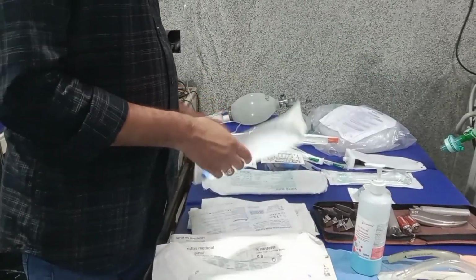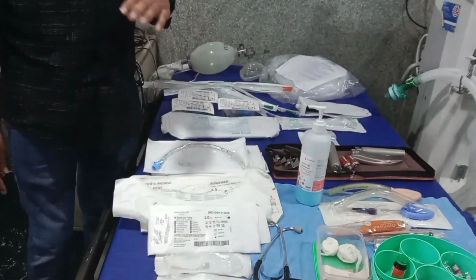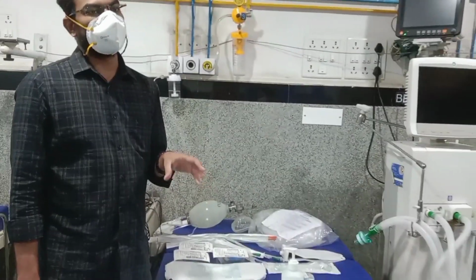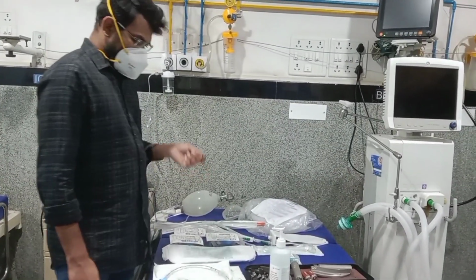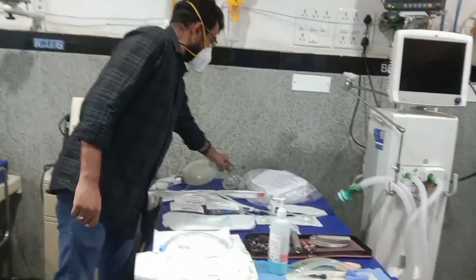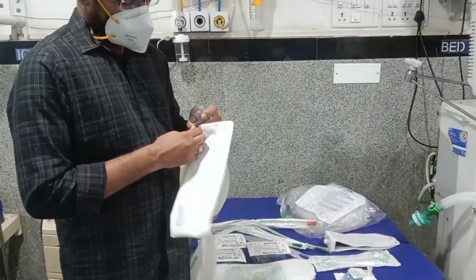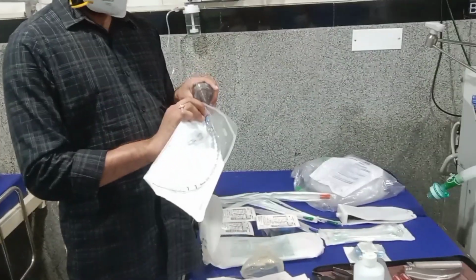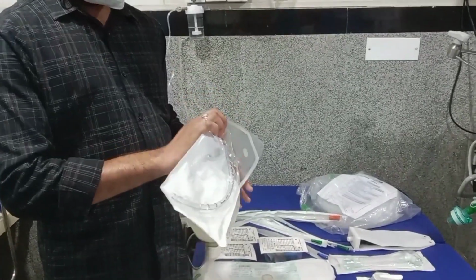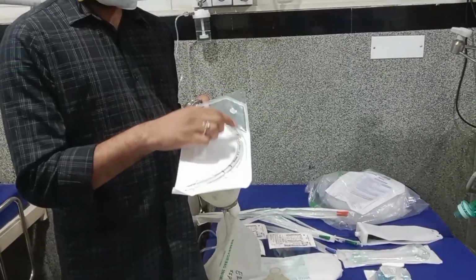Later on, we should connect the ambu and do the ambu. Meanwhile, in the same process, we should make sure that patient vitals are maintained. Once we put the tube, we should take off the mask and connect the ET. Inside, we check the airway. So we can connect it here, and we do ambu. By doing ambu, you will find a fog formation inside the tube.